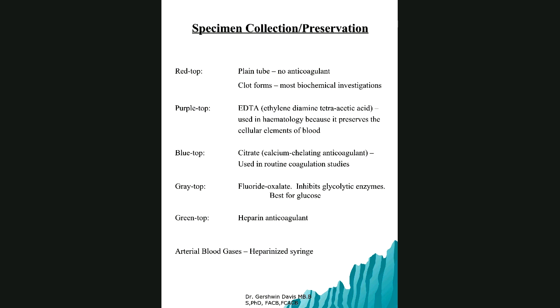For example, if you're doing a stat sample, an immediate sample, you're going to need a green top tube that contains lithium heparin. Why? Because you don't want to falsely elevate the sodium if you're using a sodium heparin tube. So that's very important. Those green tops are heparin. At least in our setting here at Mount Hope, we use a green top syringe to do your blood gases. Yes, arterial blood gas, you mentioned that, and that green has either lithium heparin or sodium heparin. But what else do we use green tube for?